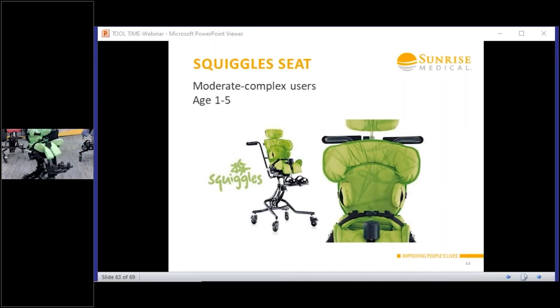So heaps and heaps of adjustment and growth. And I think paediatric is one place where we as clinicians need to feel quite good about widening those hip guides, increasing the depth, increasing the length, getting that height up, because kiddos grow so quickly. So if you've just got a little Allen key set in your therapy bag, you can really grow that squiggle seat for them.